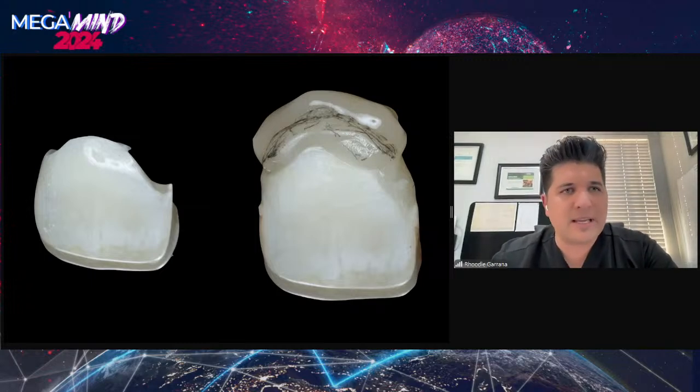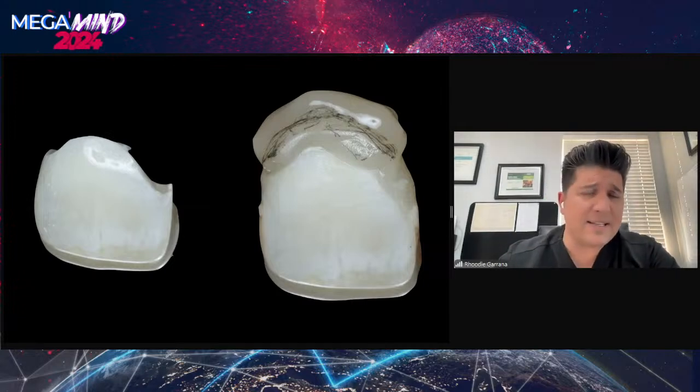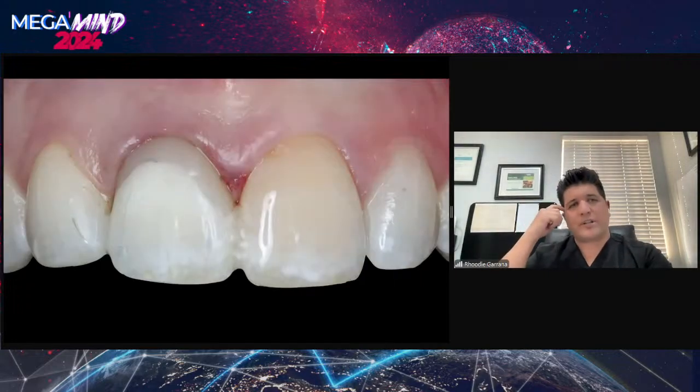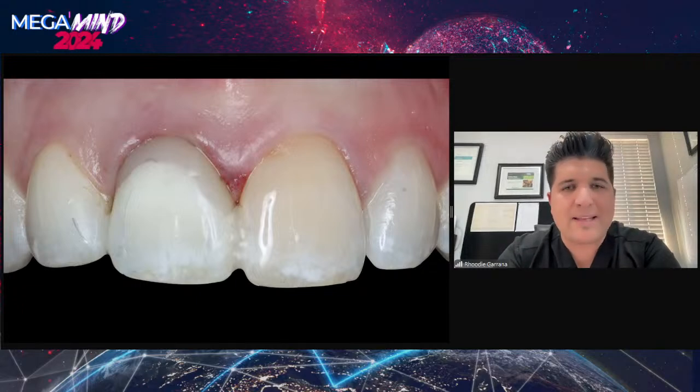So I took the tooth that we had sectioned off, and I added some composite, and I used the pencil to mark off where I wanted my zenith point to be. And these photos are very rough of when I first started. And then I bonded the crown back to the adjacent teeth in place at the ideal position, highly polished composite to stimulate hemidesmosomal attachment to that area.